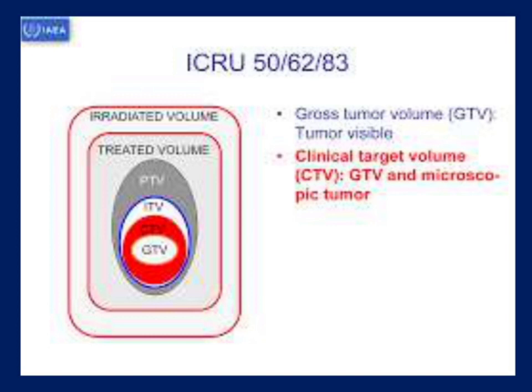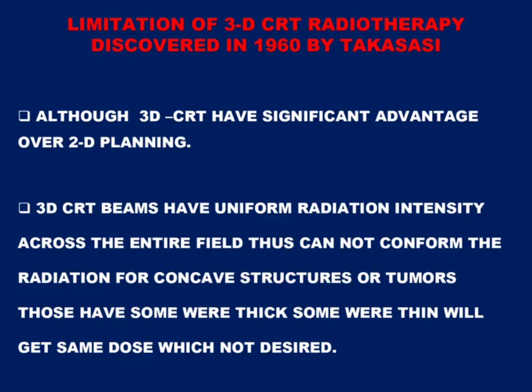But what were the limitations of 2D radiotherapy planning? The treatment is done in only two dimensions; width and height are considered, but the depth of the tumor was not. A lack of involvement in defining the clinical problem and a deficiency in the algorithm for computing the dose were the biggest problems. A failure to compute the dose throughout the volume of interest was again a big problem. And certainly we cannot afford to handle non-coplanar beams in 2D radiotherapy planning.